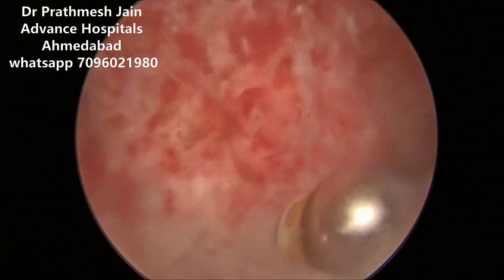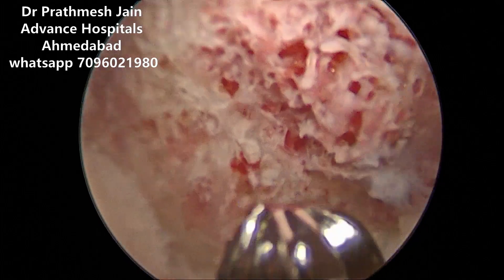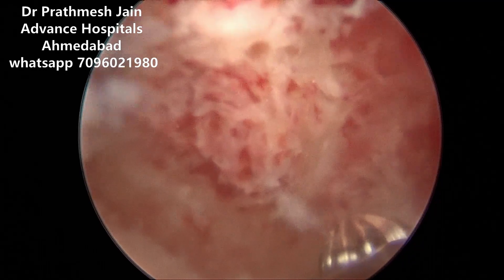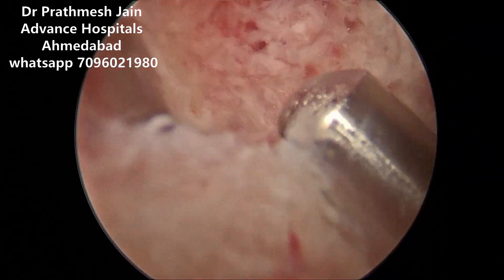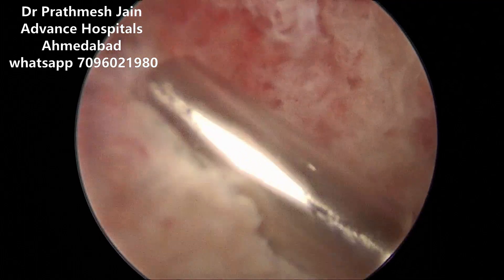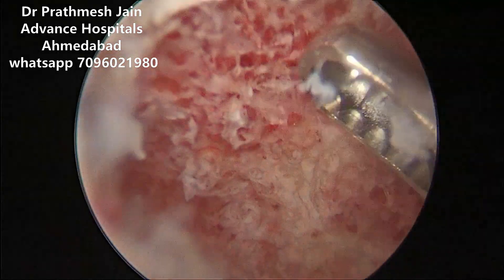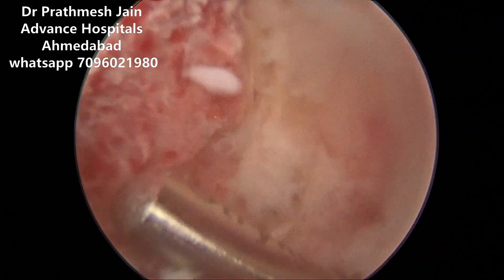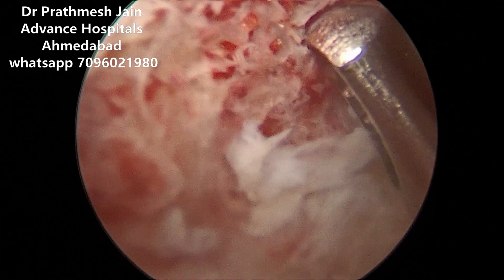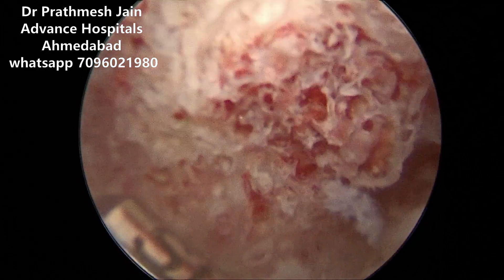You may need to use your cautery frequently because this is a region that will bleed. Once you do a resection, you can go onto the posterior and anterior aspect of the neck. The hip anatomy gives you a nice hip space anteriorly at the level of the neck, whereas the capsule attachment is more proximal on the posterior aspect. So you have a narrow region posteriorly but a broad region on the anterior neck. If you use your shaver here, you can use it as a retractor to enter into the peripheral compartment.